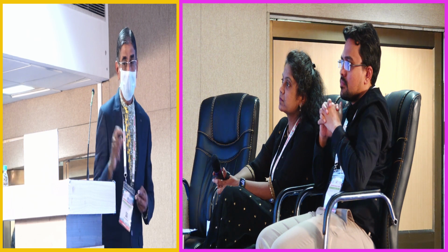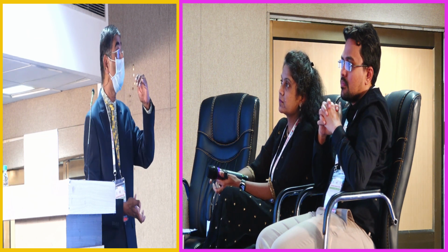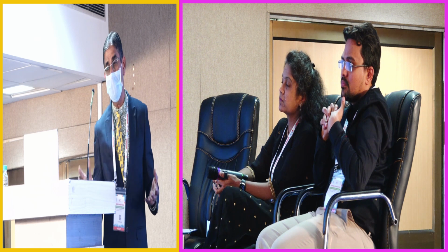Second, I would say they need to test the RO system, though they might hand over to maintenance. The calcium, chlorine and chloramine test is mandatory because we don't use a 5-liter bag, which is already sterile and within the range. They have not cultivated this habit. In HD, we don't do that. We only fill the water and see the conductivity done. But here they have to do these two: one, test the RO system; second, disinfect it. If they do these two, I think they have no problems with the machine running 4 hours now. They can even run continuously 24 hours.